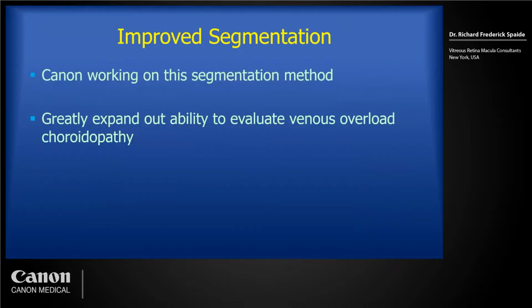I made this suggestion to Canon, and they're working on this improved segmentation method. This new method would greatly expand our ability to evaluate venous overload choroidopathy and help evaluate patients without the need for injections of dye. Thank you.